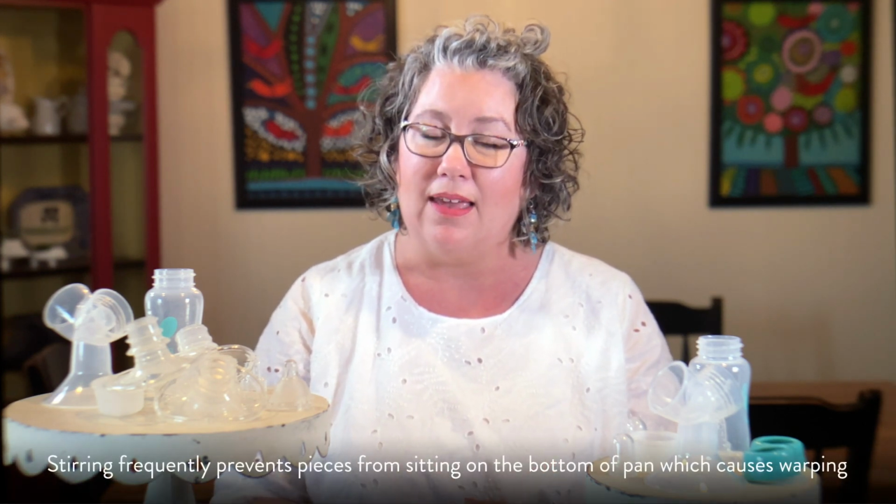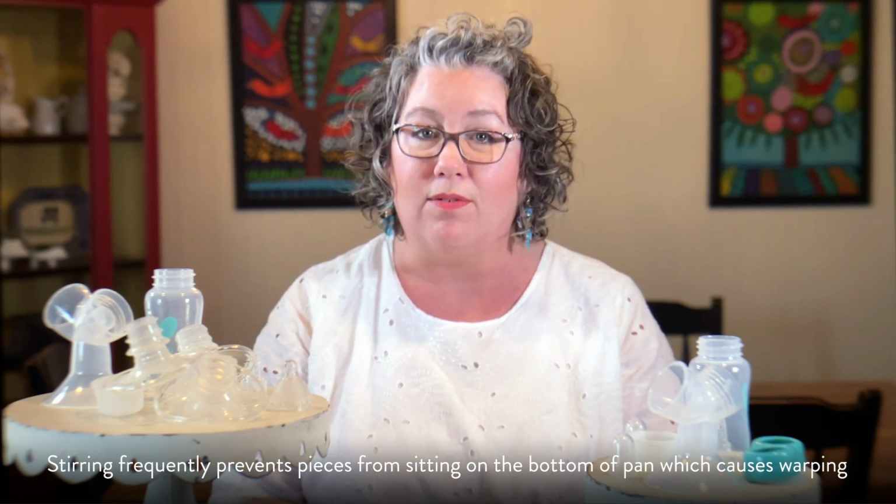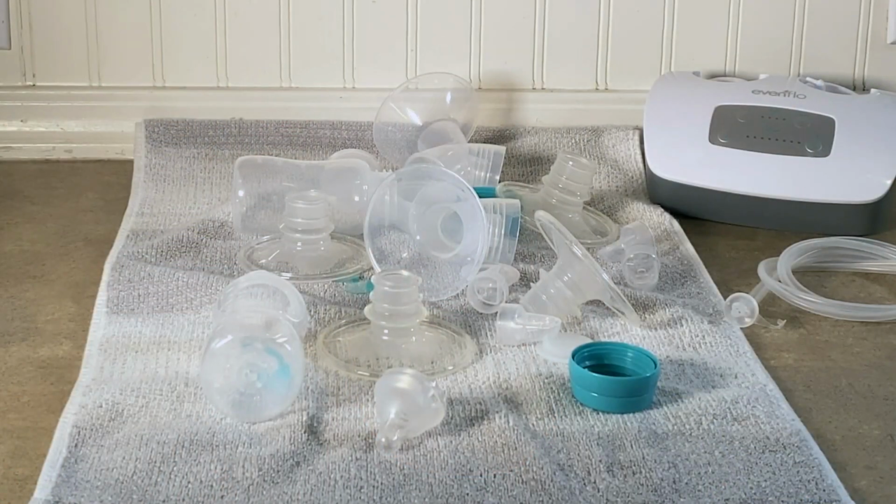What you'll find is some of the pieces float and some of them sink, and by stirring it on occasion, everything gets a chance to be brought up to the right temperature for sanitizing. When your timer goes off, remove the pot from the heat and grab some clean tongs. You'll want to carefully remove all of these pieces from the boiling water, and you'll lay them either on a clean towel or on clean paper towels, and then you leave everything there until it's completely dry.